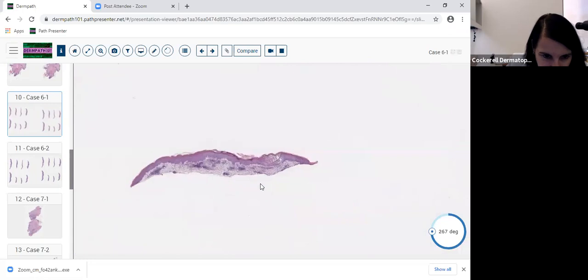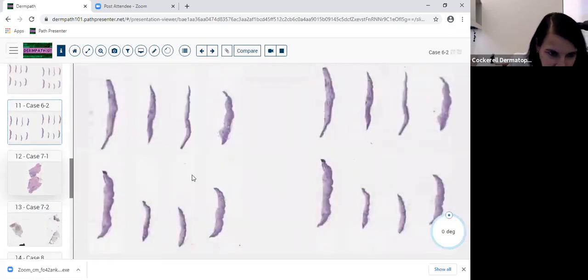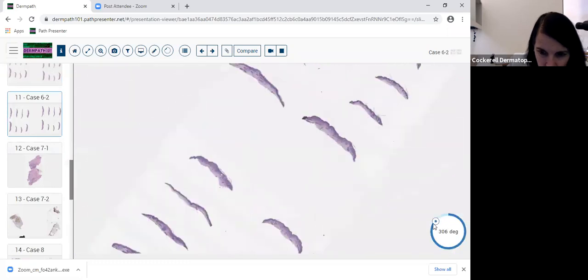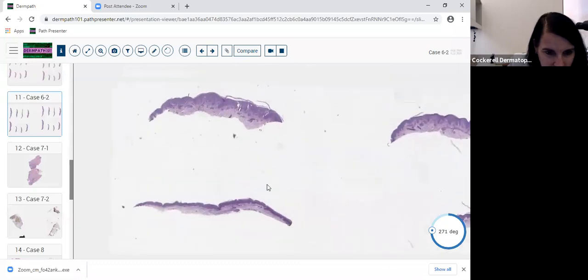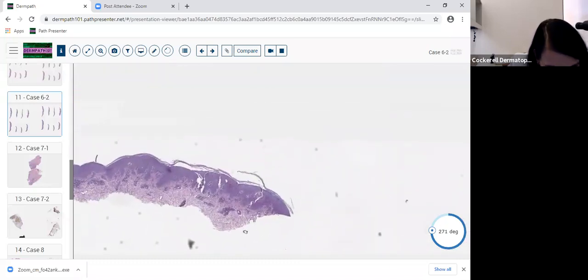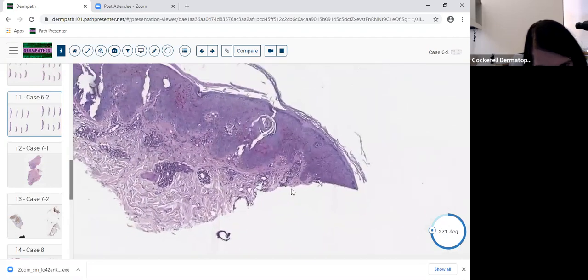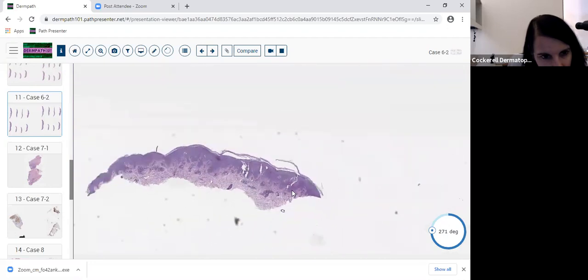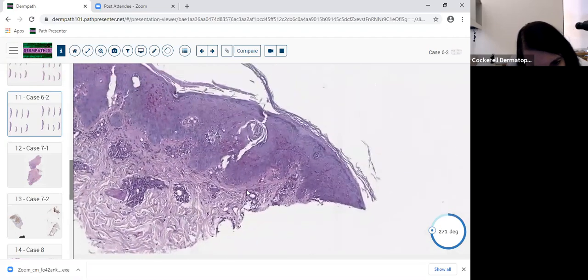All right, so let me see if I can find these hyphae on these stains. So let's get the stain. I really want to just use the stain. I want to move on with my day. I've got to move quicker here and get to the bottom of it. Let's see on this PAS. Aha. Where is this one? Let me see if this is the best piece. Here we go.